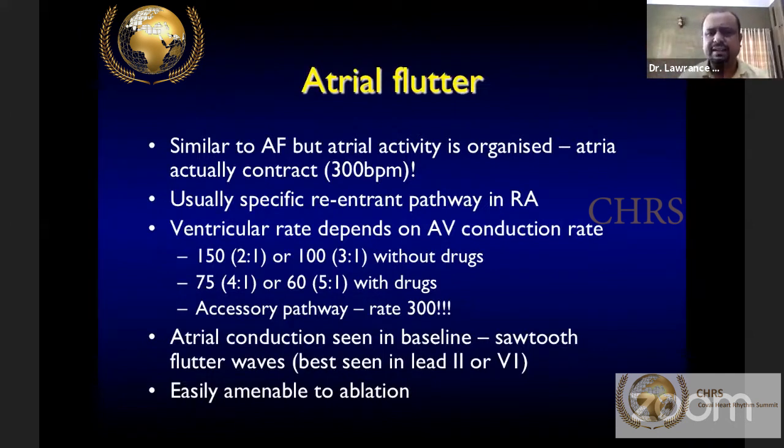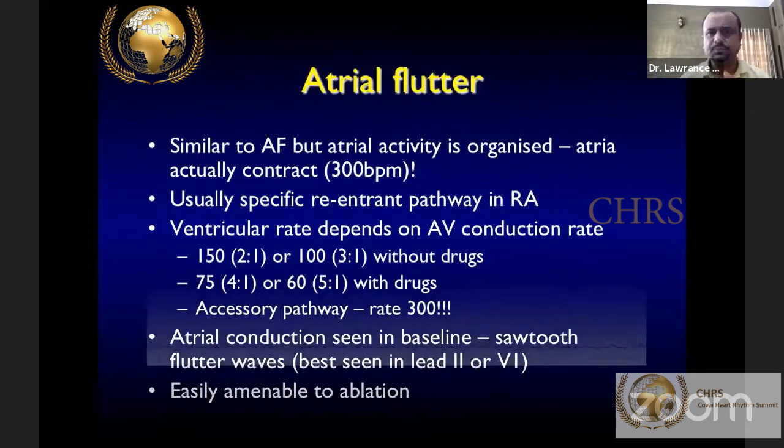You can see atrial activity in the baseline. You will see sawtooth shaped flutter waves. They're very easily amenable to radiofrequency ablation. We have a very high success rate with flutters.